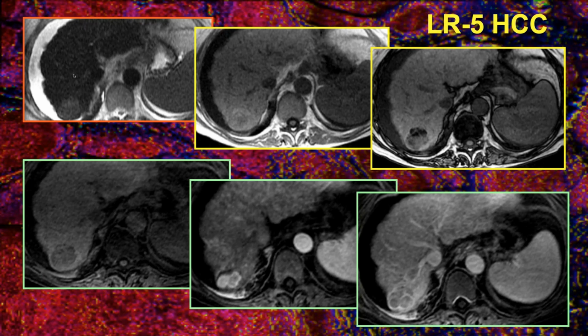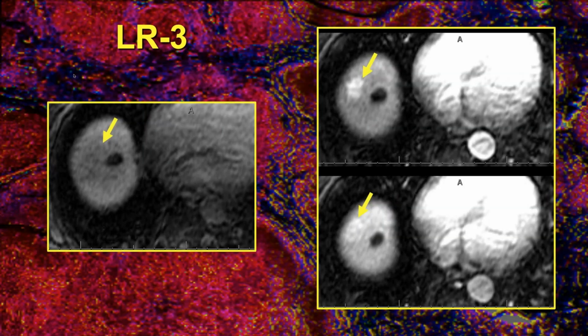What's the best management? Given its vascularity and the solitary nature, chemoembolization is a high likelihood, but perhaps ablation will also be considered. So here is a mass that would qualify for LI-RADS 3.